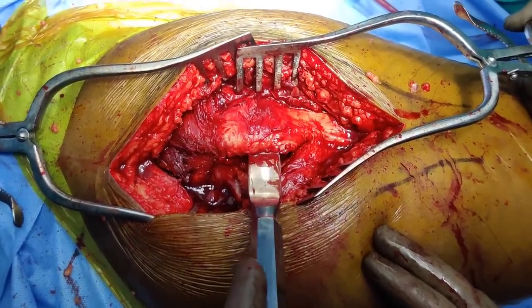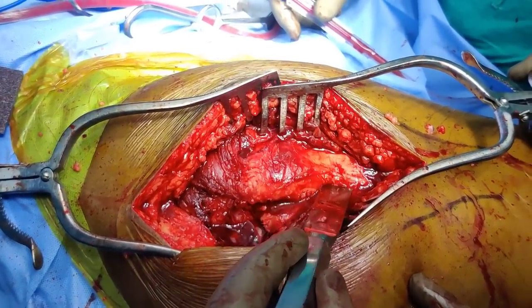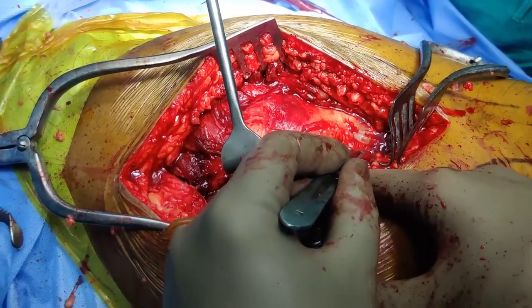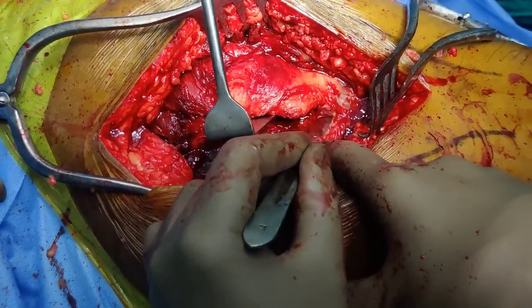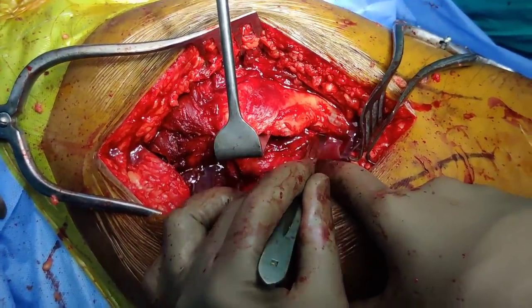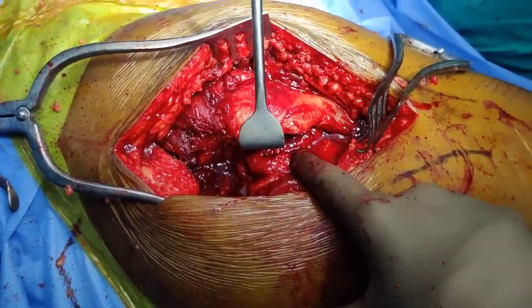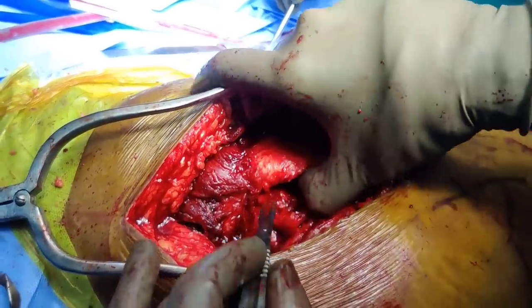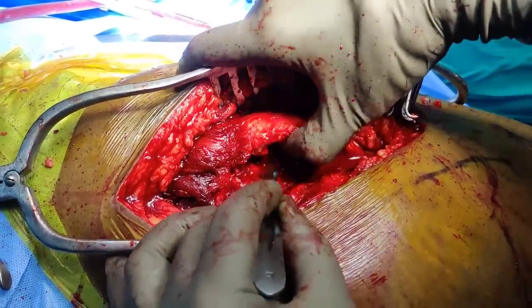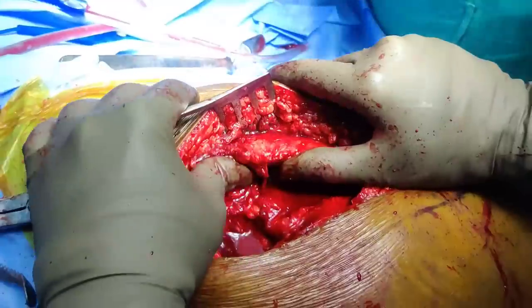The osteotomy is done. Once you lift this you can see it is complete — lift all this including the vastus lateralis and the gluteus medius in the front. Dissect first posteriorly to free the vastus lateralis, and then continue the dissection from the front. Release it inferiorly, then put the knife and continue dissecting in the front to lift the whole gluteus medius and expose the anterior capsule.